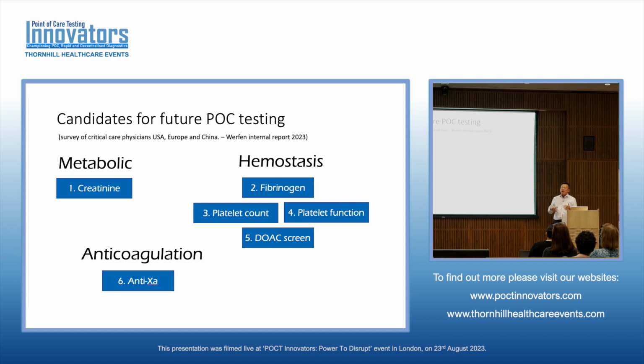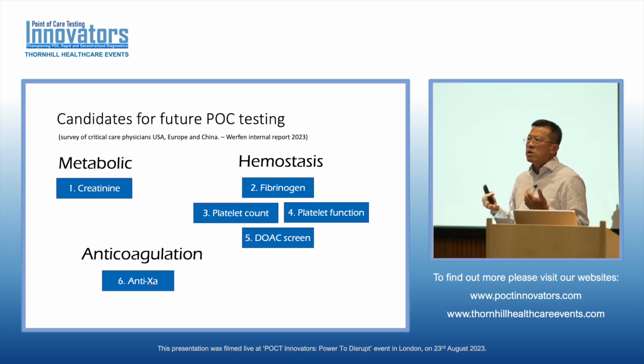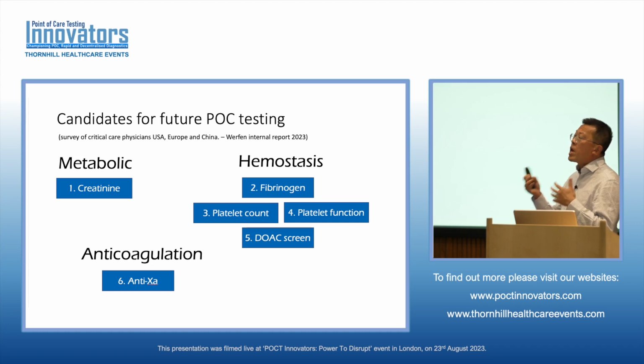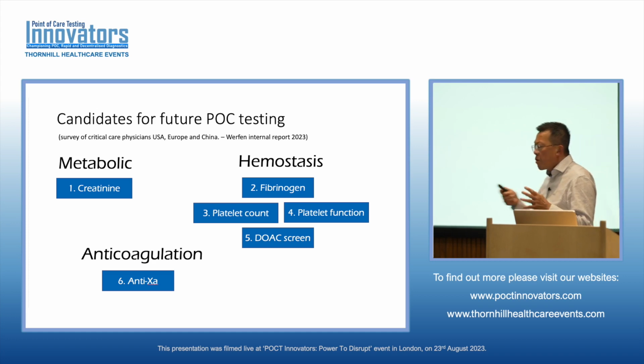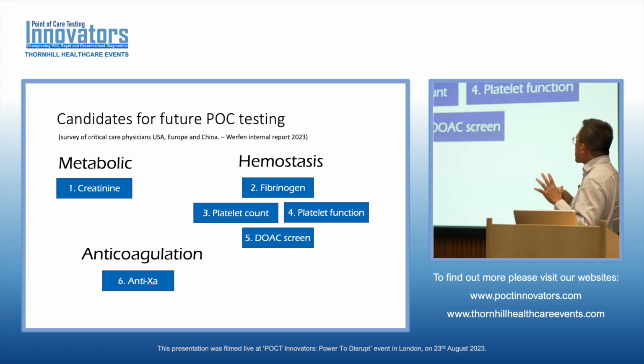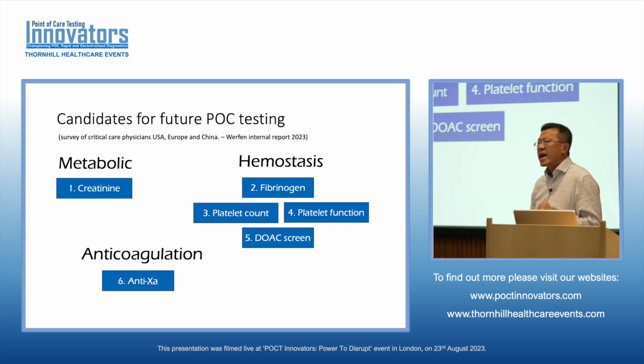So the angle I'm giving you is that you are very much involved in delivering and managing point-of-care testing. But what I'm going to tell you is what I believe many critical care physicians are asking for in terms of point of care testing, which may or may not be currently available. I'm just going to give you some examples, not really to go into them in any great detail. And I've broken them down into different areas, sort of metabolic. One is creatinine. The second thing is about hemostasis. And the third area, if you like, is about anticoagulation.